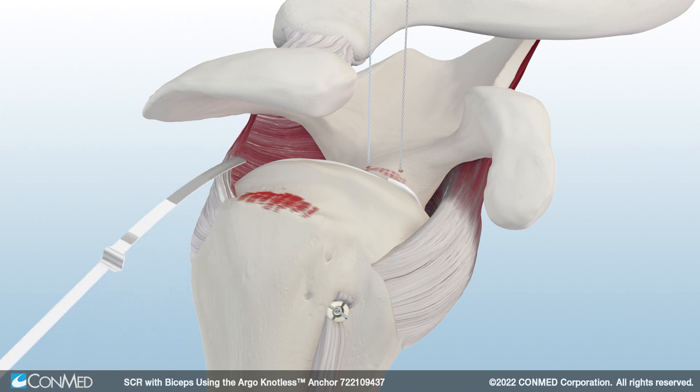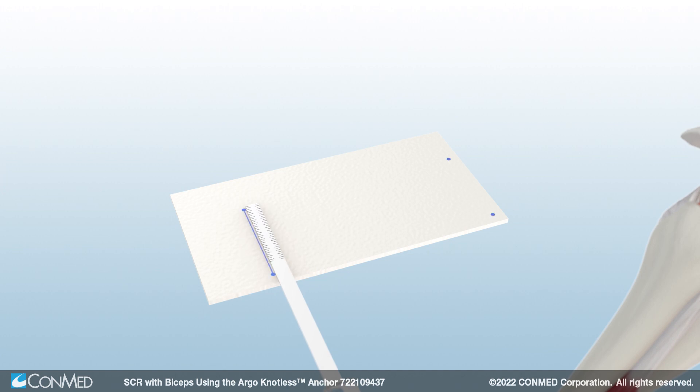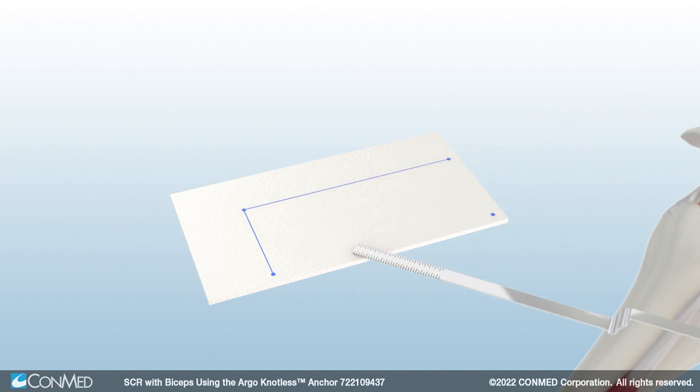Finally, measure the distance between the posterior glenoid anchor and the posterior greater tuberosity footprint. Transfer the measurements onto the Allopatch HD, which is a minimally processed, high-quality, acellular human dermis allograft that is ready to use off the shelf in minutes. Leave a 3- to 5mm border on all sides of the graft and trim to size.